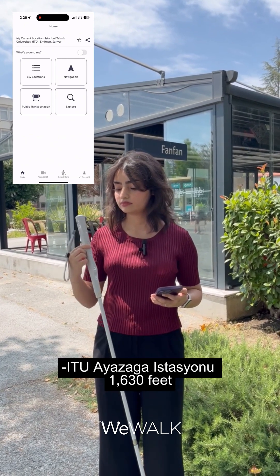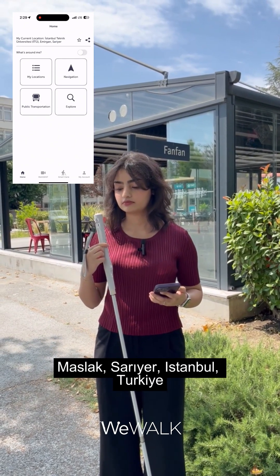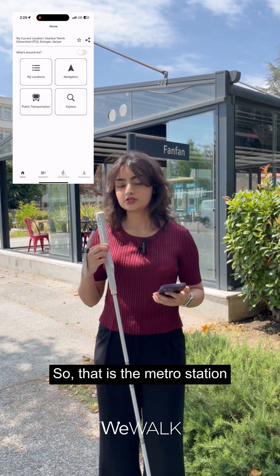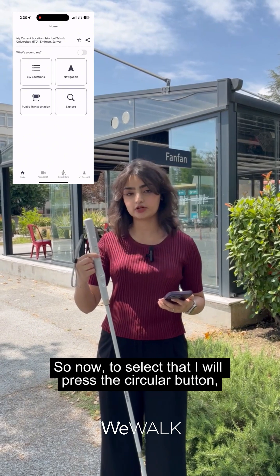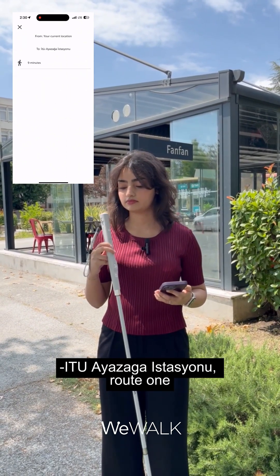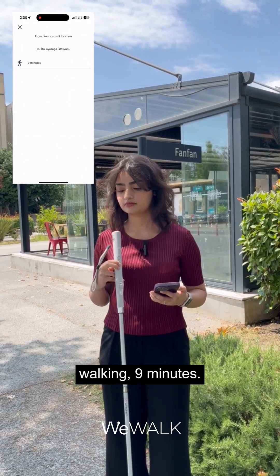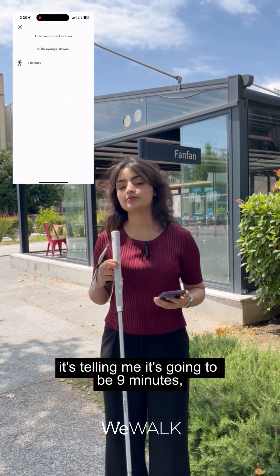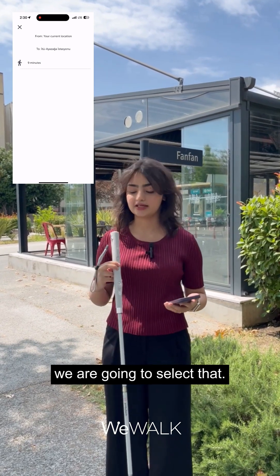Address 1: ITU Ayazaga Iztaccioni, 1630 feet — Maslow Sarayar, Istanbul, Turkey. That is the Metro station I want to go to. To select it, I will press the circular button — the third button on the cane. It confirms: 'Selected address: ITU Ayazaga Iztaccioni.' Then: 'Route 1 — walking, 9 minutes.' Since that's the only option, we are going to select that.